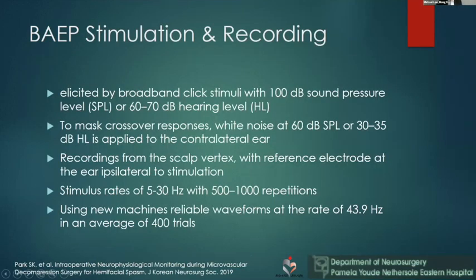For stimulation, usually we'll do a click stimulation with 100 decibel sound pressure level, which corresponds to 60 to 70 decibel hearing level. So we have to be very sure about the method of stimulation.